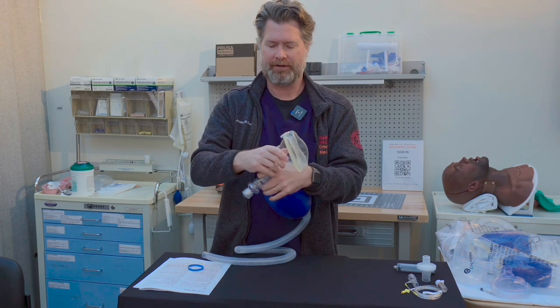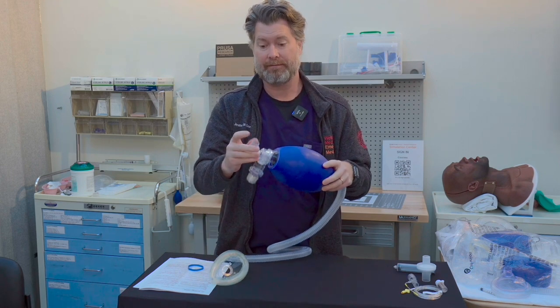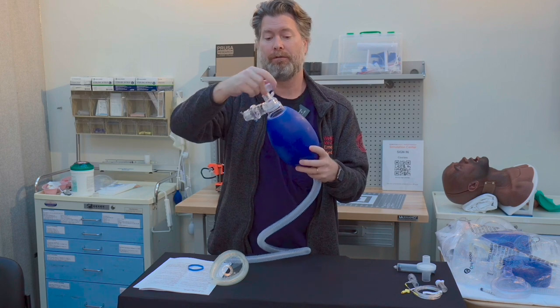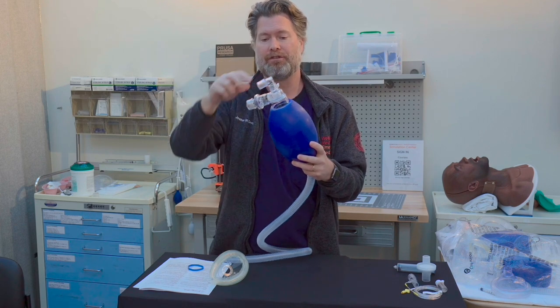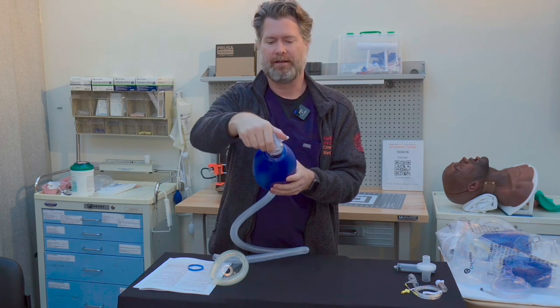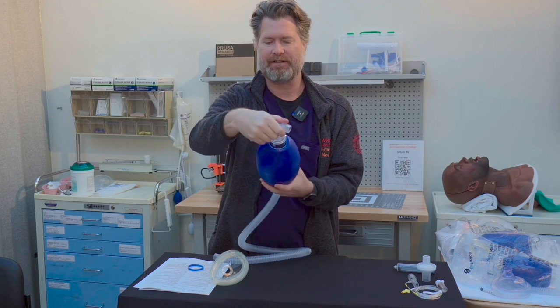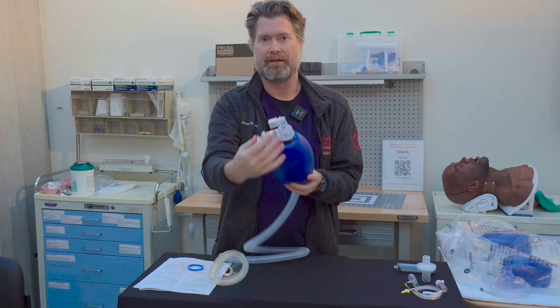Then we get to the connector — it's a standard connector and it does move, so you can adjust the direction you want, whatever is most comfortable to get to the patient's face. Typically you want this facing upwards and out to the side; if it's the other way around it can be a little bit difficult.